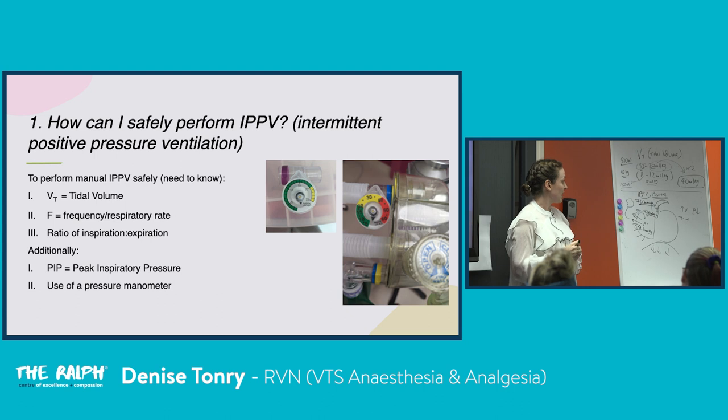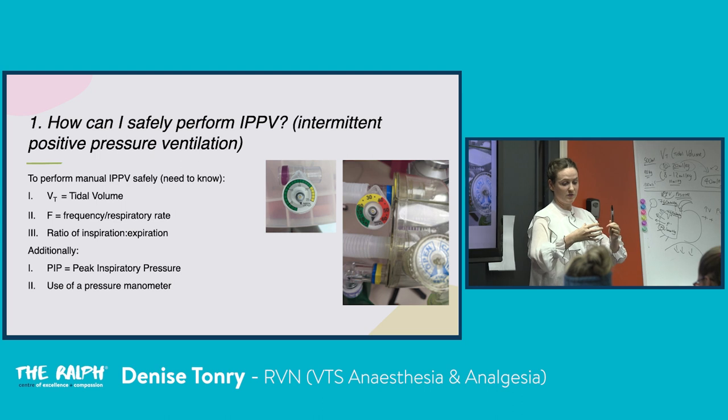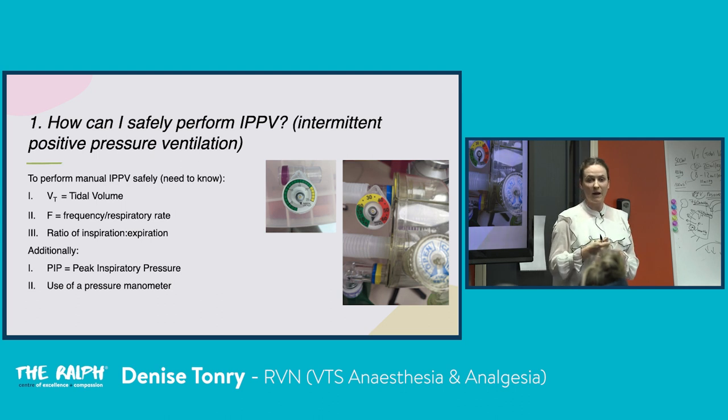So one of the common consequences of providing IPPV is a drop in blood pressure overall, a drop in cardiac output, simply because you're causing positive pressure, it's abnormal, you're pushing against these vessels, primarily the vena cava, which is bringing all the blood back to the heart, reducing the amount of blood that's coming back to the heart in that heartbeat, and overall you get a cardiac output drop. We commonly see this when we have invasive blood pressure. Sometimes an oscillometric is a bit slower because your next reading, in 5 minutes, might be lower. You may have stopped IPPV. But generally when you perform it and you have real-time readings, you do see this drop overall. And it can remain there if you continue to ventilate them. So you may need to provide them some support.